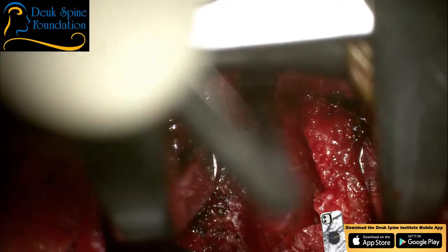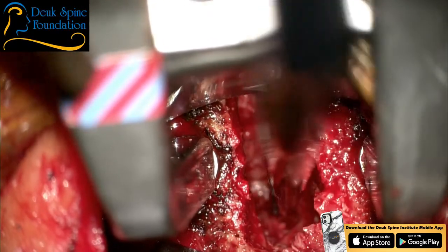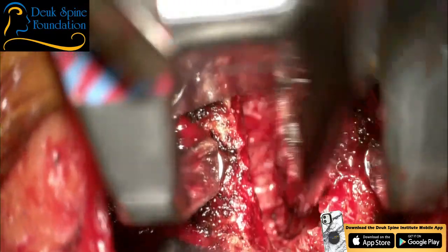Nice job, Patel. You got a little piece of disc there. So you see what I'm doing, folks? I'm opening the hole where the nerve goes out. It's called the neural foramen.